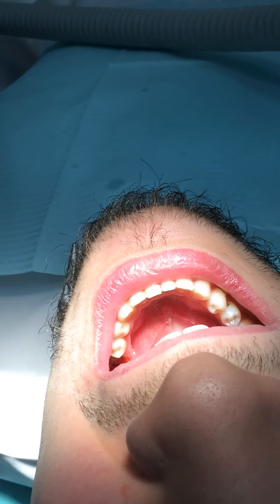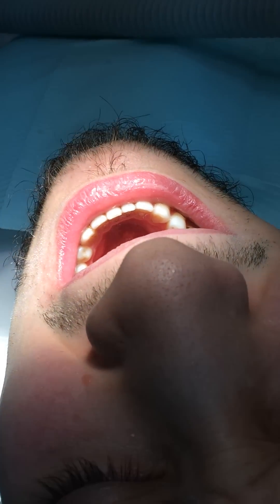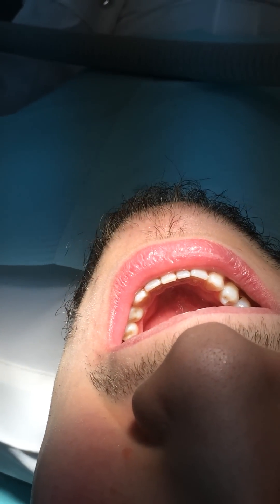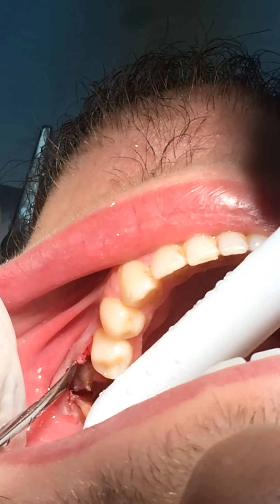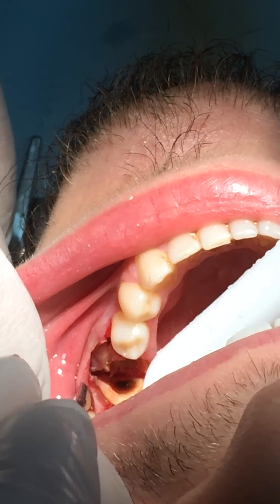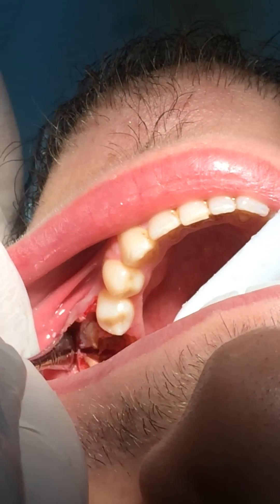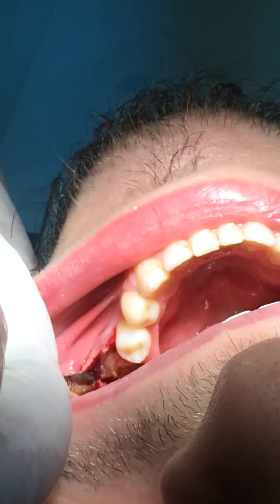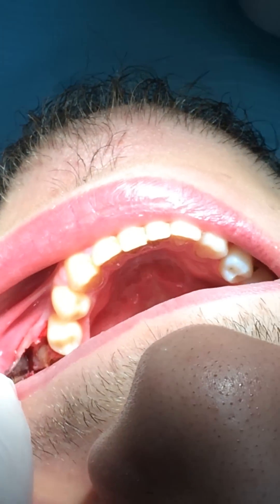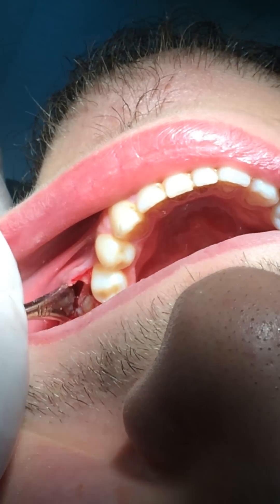What are we doing now? We chose to separate this root because there is decay and it's not easy to remove without dividing the root. First we raise the flap — you see — and we took the bone away. After that we divided the roots into two parts.